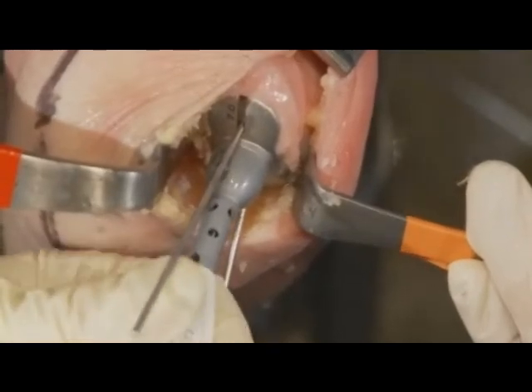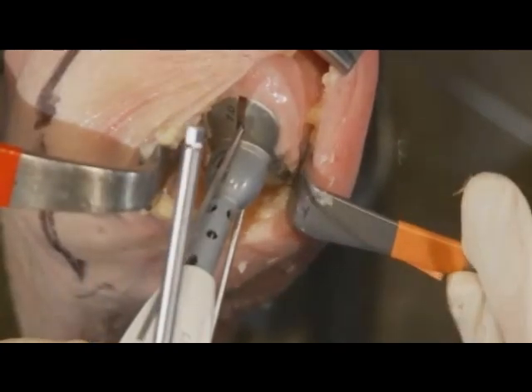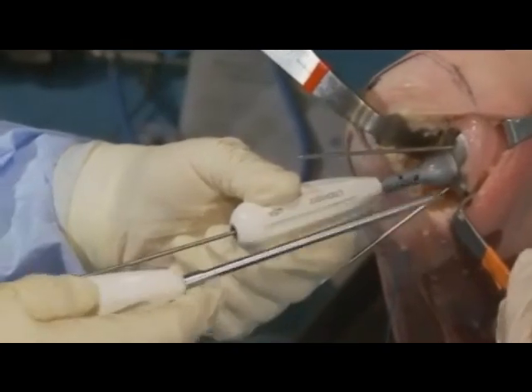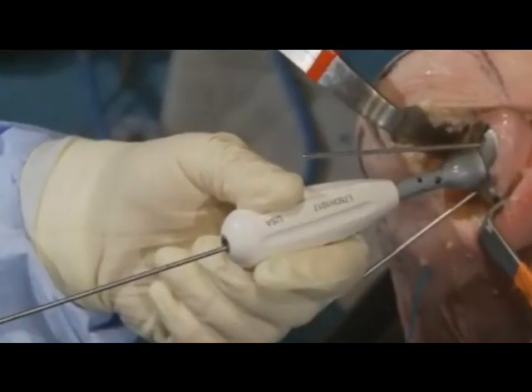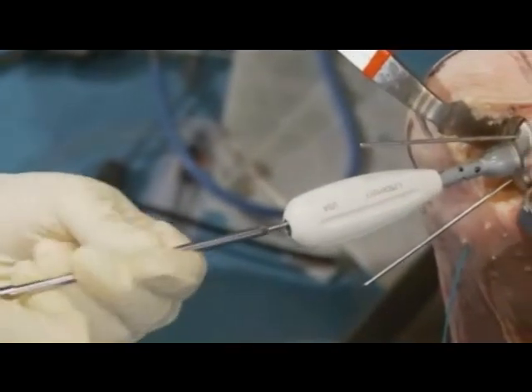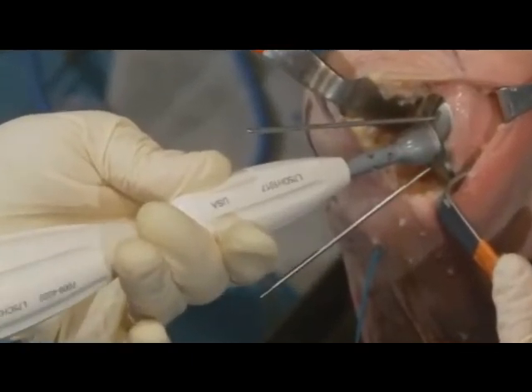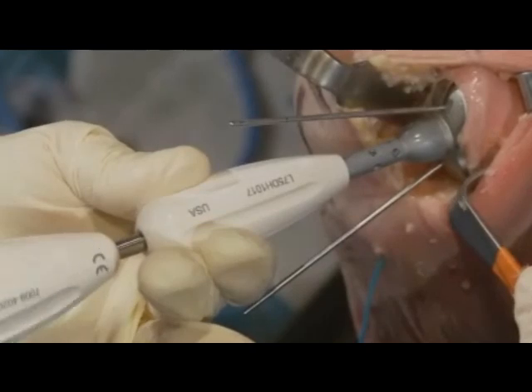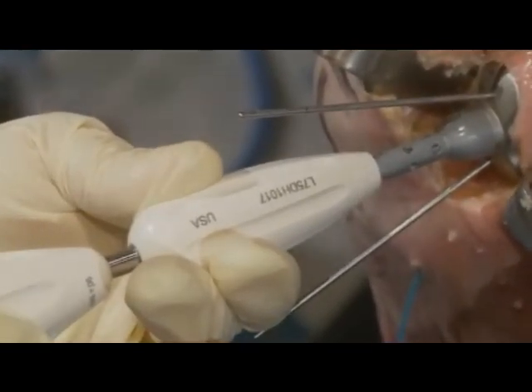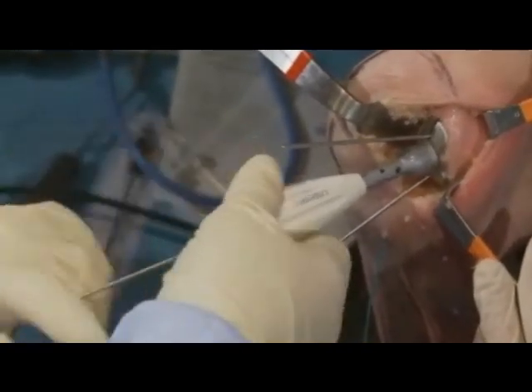And you can see, it's nice and tight. You can see our implant still fits very nicely anatomically. This screwdriver here, you can see it's a screwdriver, and at the bottom end it has a little shoulder. Once the shoulder touches this device, that's the depth of the screw that you need to set. So we set it all up, go down, engage the screw, and turn it in. This is not a hard tightening. As soon as that edge touches there, that's it. The screw thread is set, and you don't need to turn it anymore. So now we have that. Our screw is in.